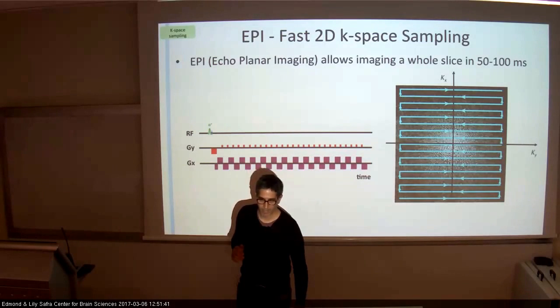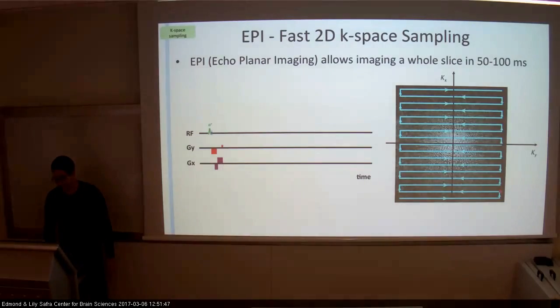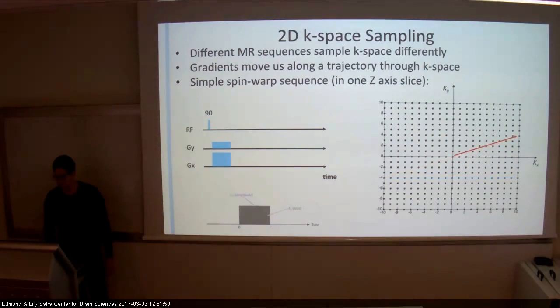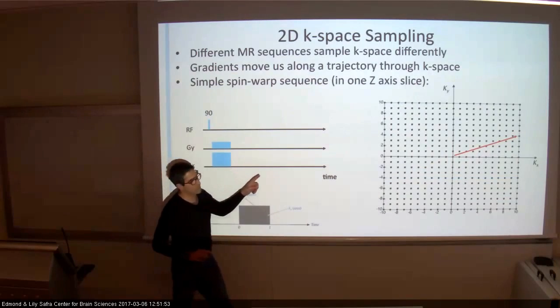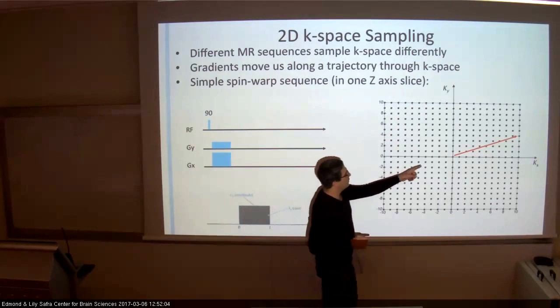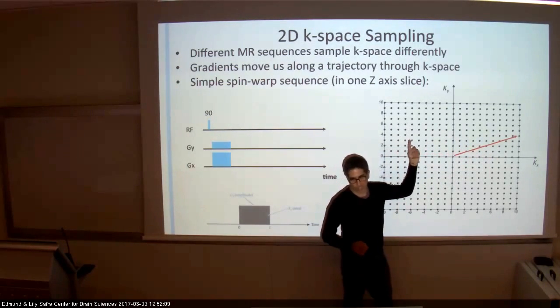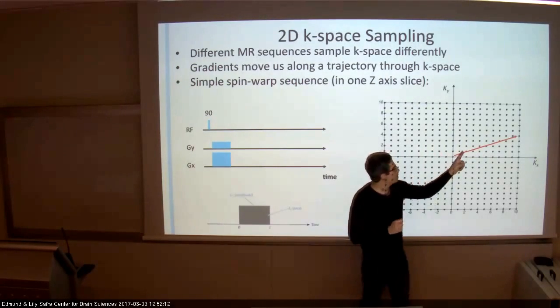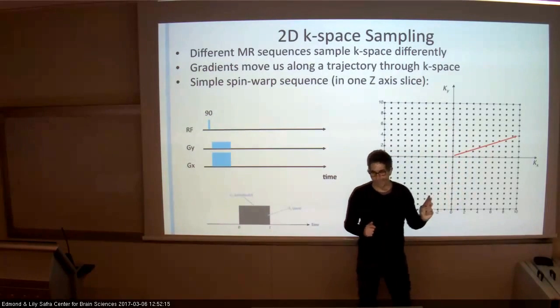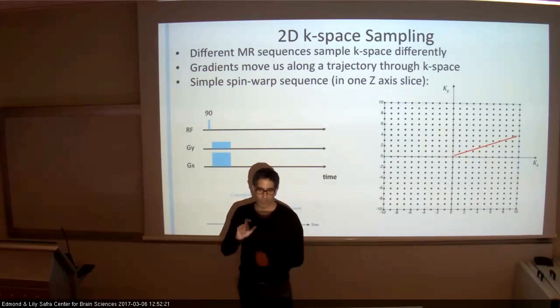Shifting inside K-space. Not sure. Let's do that again. We said that a specific X and Y will take us to a specific location in K-space, right? With some kind of winding in X and some kind of winding in Y we get to a location in K-space. And as I turn it on for a longer time, I'm going to measure a specific line in K-space. Now, if I change the X and Y, I'm just going to jump. The same gradient, but for different durations.